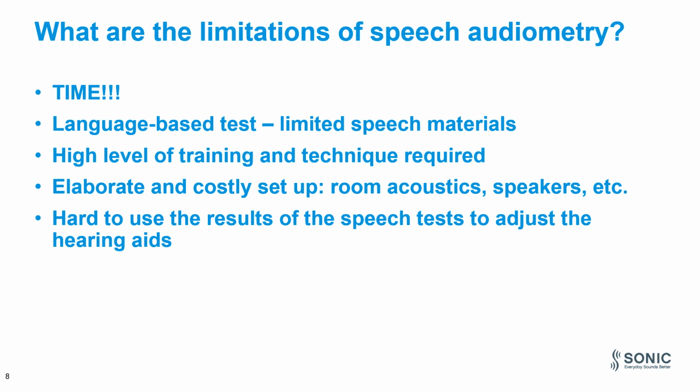No wonder speech tests are considered an optional test for a lot of clinics, because there are simply too many challenges in making it part of the clinic protocol. When I was still practicing, it was something that I did more thoroughly only when I needed to, but I did not do it for all my clients because it was too time-consuming, despite the many benefits it gave me in terms of client counseling.